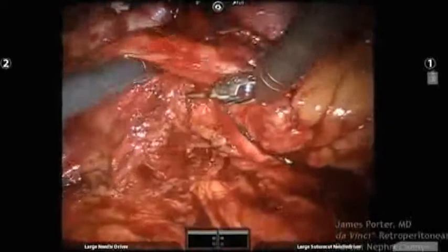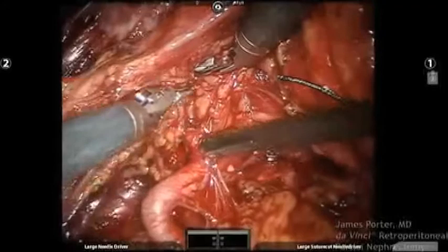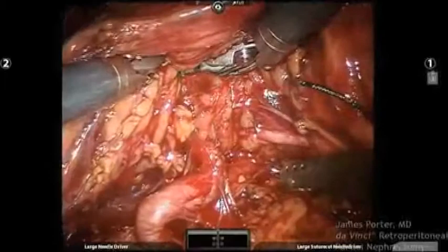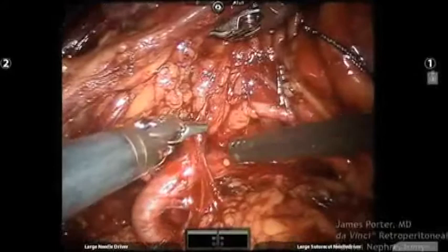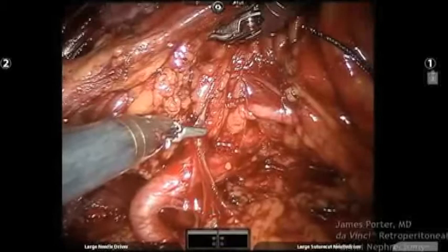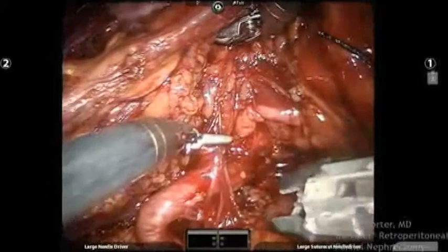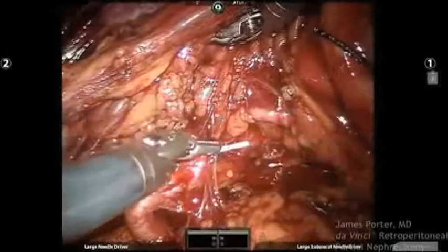We got a little bleeding here, Nance. Let's check it out. Right down here at the base of this thing. Can I have a small metal clip, please? Let's see. Just below, just with the tip. It's coming right from here. It's not a big deal. Here we are. We pull back a little bit. Right there. Good. That's precision.